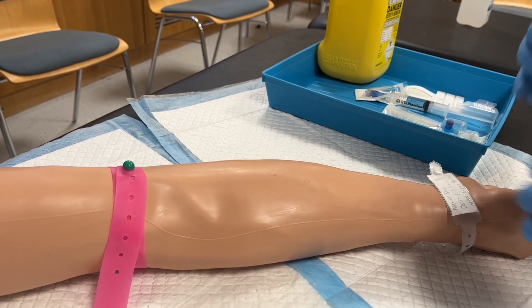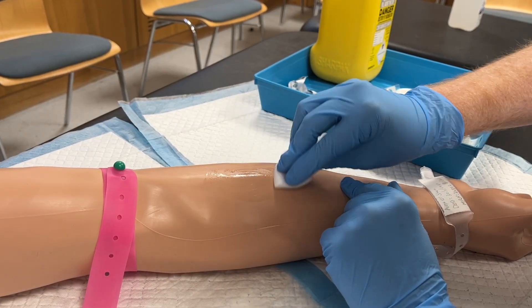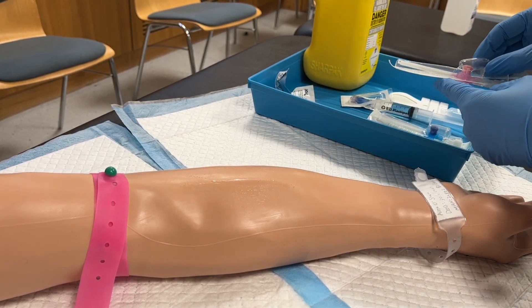To look at this process in more detail, after the tourniquet has been applied and the ideal vein has been palpated, the skin is sanitised with an alcohol swab using circular motions. Allow the skin to dry as you remove the cannula from its packaging and assess its components.